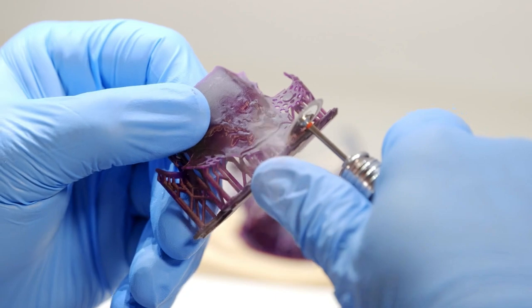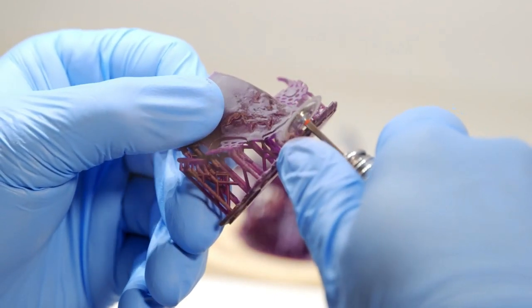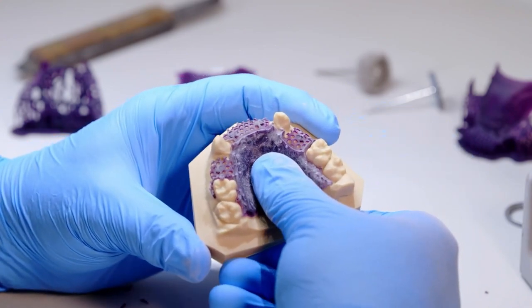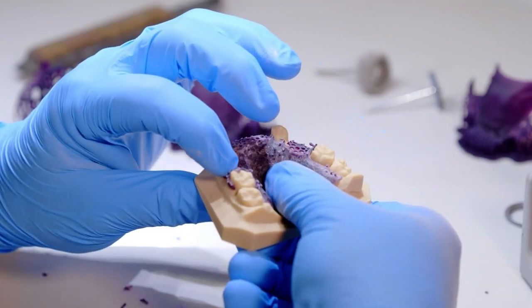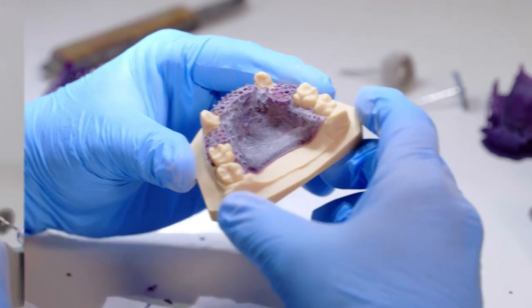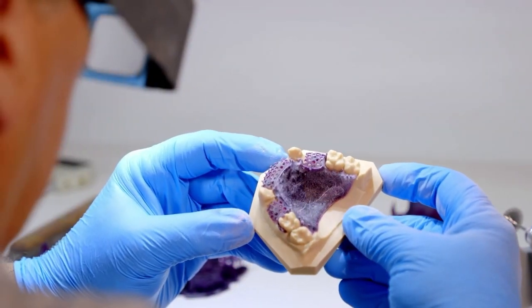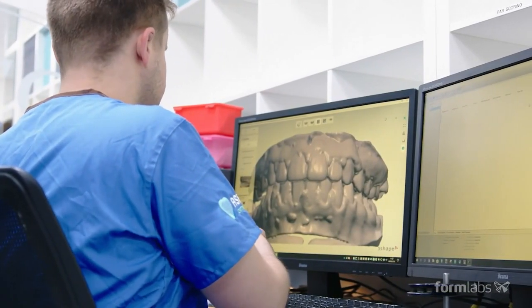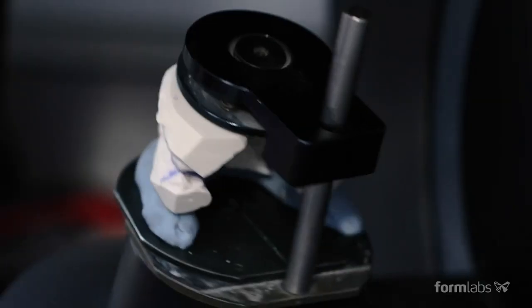The Form 3D Plus is well suited to dental applications because it is capable of producing models with very high levels of detail and accuracy. It is also capable of printing a wide range of dental materials including dental resin, surgical guides, and biocompatible materials that can be used for direct patient contact.